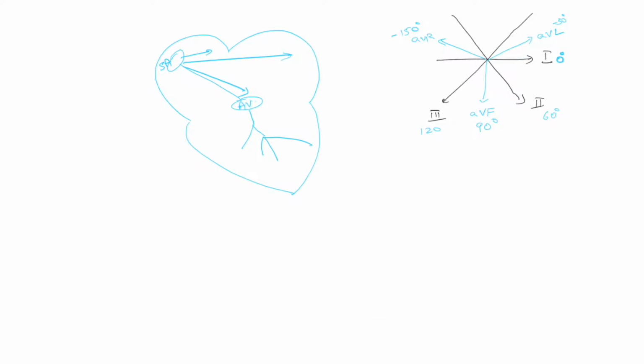So one thing to kind of think about is if you have so many different waves of depolarization at any given point of time, would you actually see every single wave of depolarization on the EKG? Let's consider the following example. Let's say you have the following vectors, and these are all facing rightward, and then let's say you have smaller vectors facing leftward.